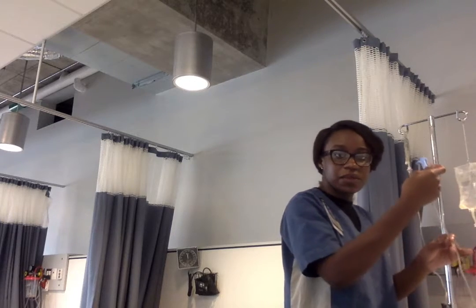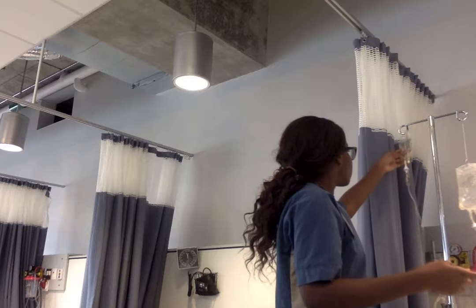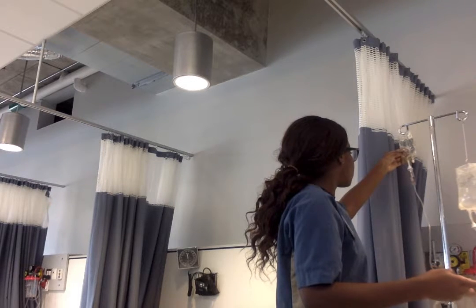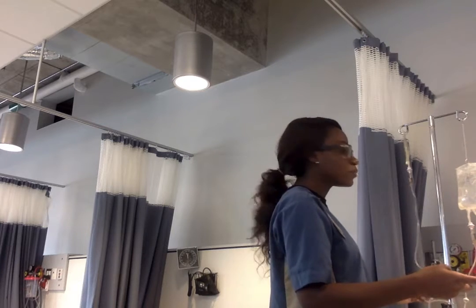And I'm controlling it with my primary tubing, making sure that this is opened as well.